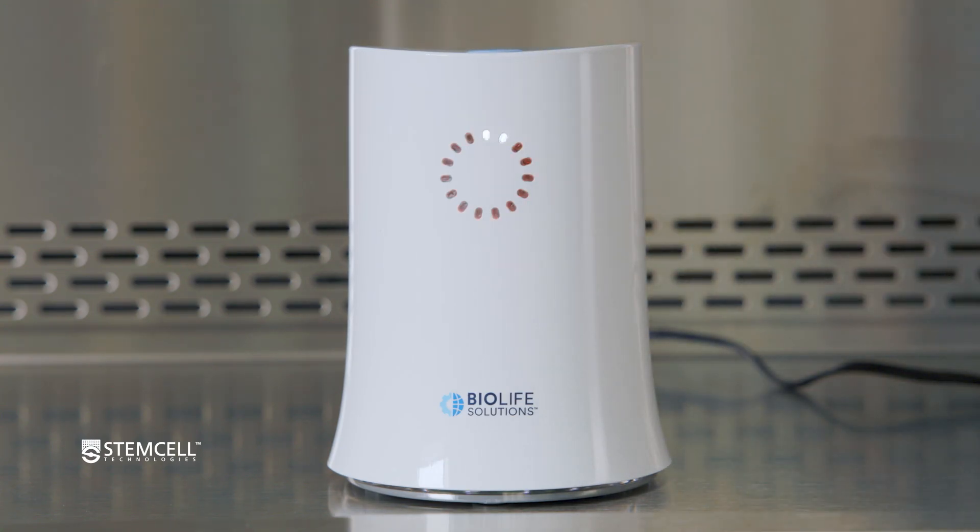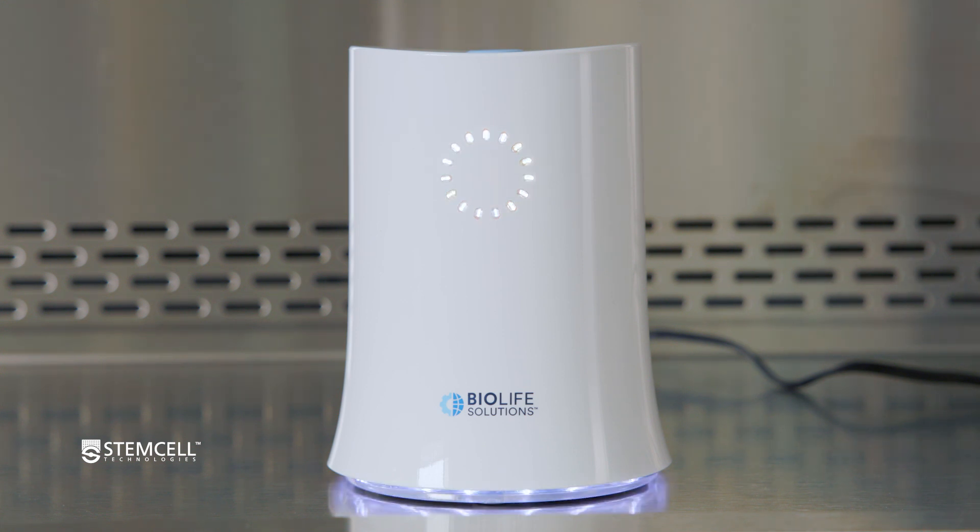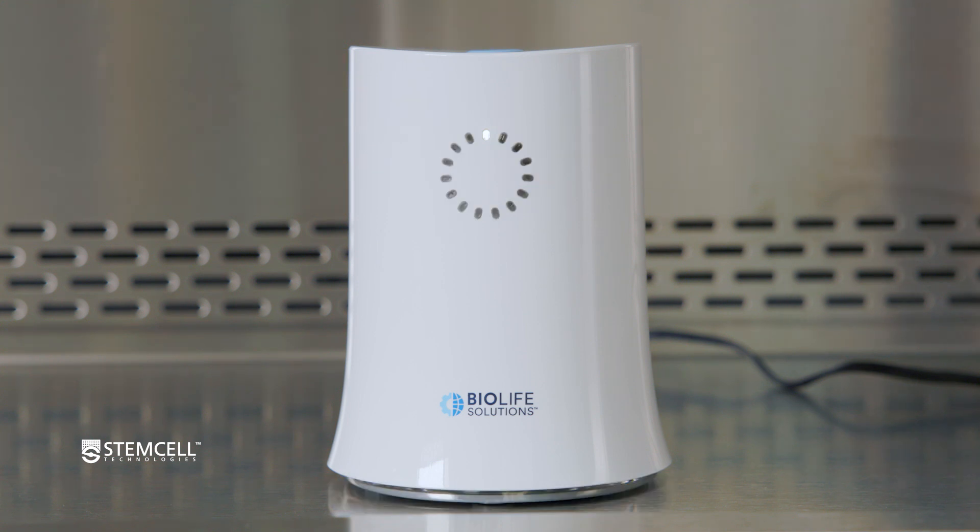Next, turn on your Thawstar system. It will need a moment to warm up. The system is ready once the LED light circle is complete and the lights stop flashing.